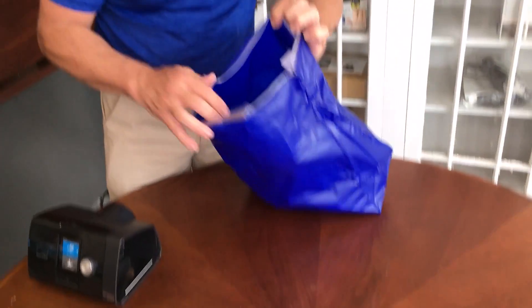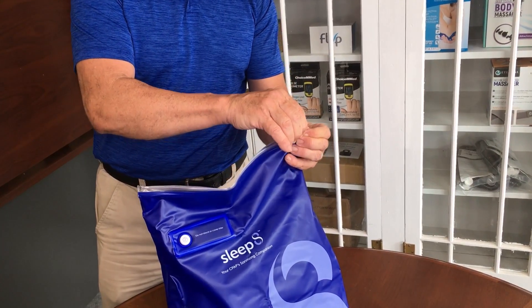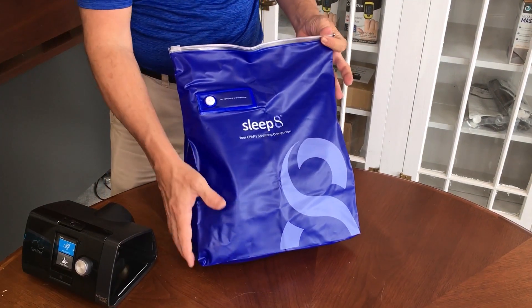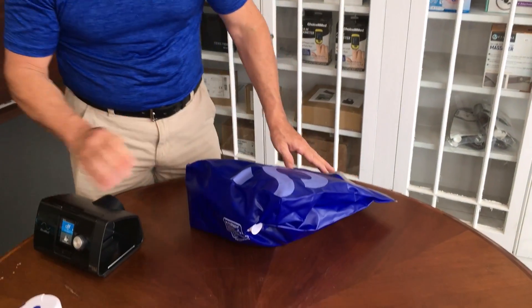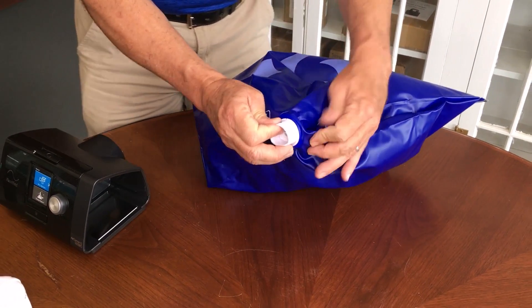All right. The bag seals up — it's kind of like a zip-lock. Just pull that across; it seals up and clicks a little bit at the end to ensure it's fully sealed. It's very important to connect that tube in the bottom of the bag because you want to be sure that the ozone is actually going through your tubing.